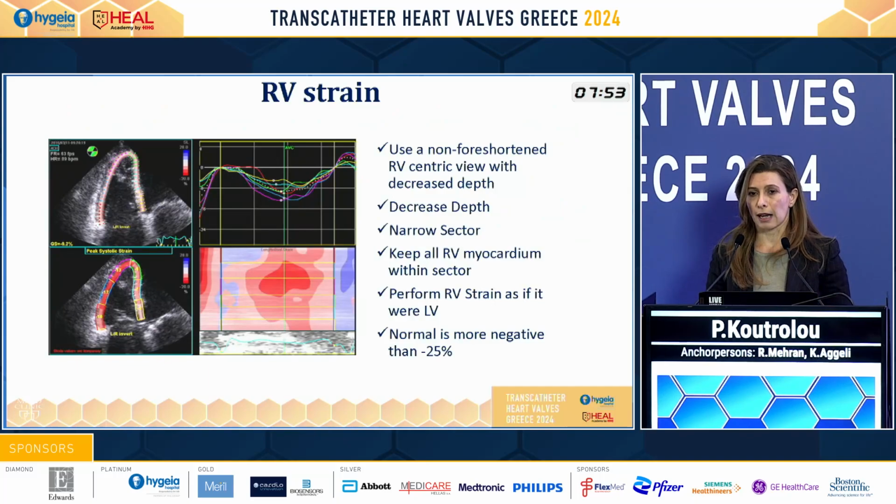RV strain is a measurement that we do. It's actually an easy measurement that we do in our everyday life. We used to do it for the LV, but in the last many years we do it for the RV. It's, I would say, a measurement that is easier to do for the RV than for the LV. We actually do the same thing.